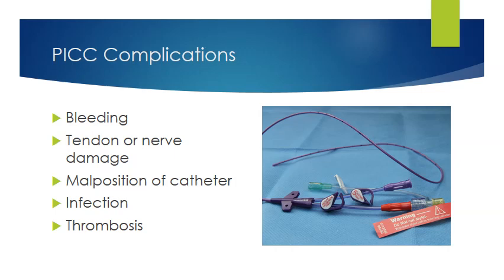Now look at this picture here on your slide for just a second, and this is actually what we call a power PICC, and it's going to depend on the facility that you work at as to if you have these power PICCs or not, but this is what it will actually look like from the little hub there. That's the part from there back where the ports are, is what you would see hanging out of the patient, and then the long skinny line at the top of that picture is what it looks like in your patient.